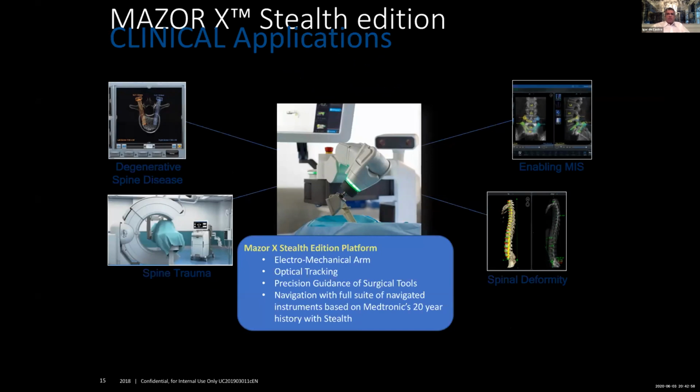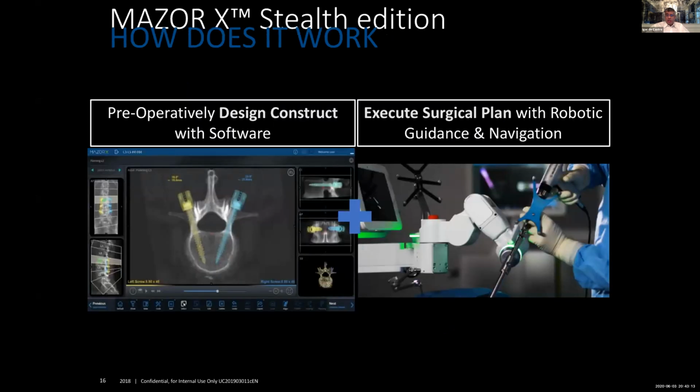So I put those pictures for you to see the C-arm in the left lower corner, the picture on the screen on the top, how the robot places the screws, and the 3D reconstruction of the imaging, how it looks in the OR with the preoperative pictures. That's exactly what you see on the tech from Medtronic, it helps you to do the planning. So it's very, very helpful.